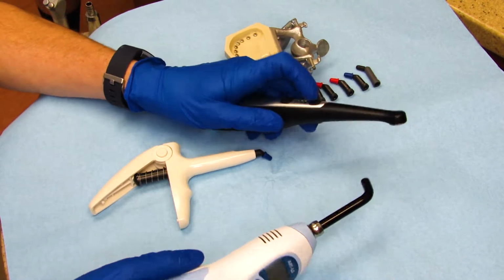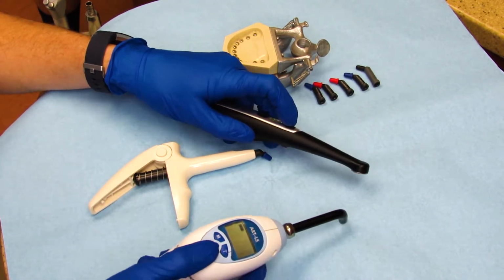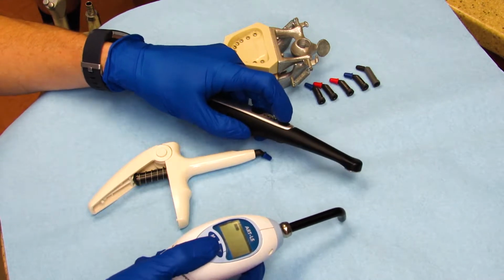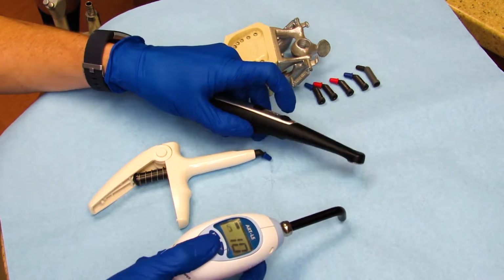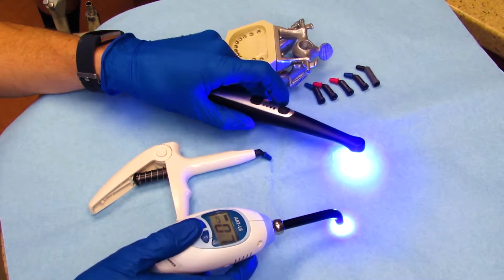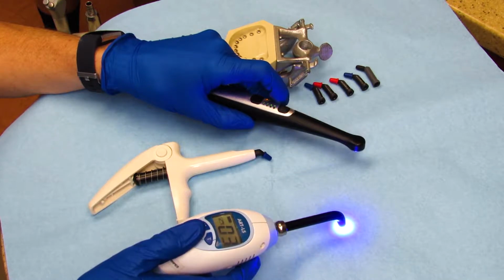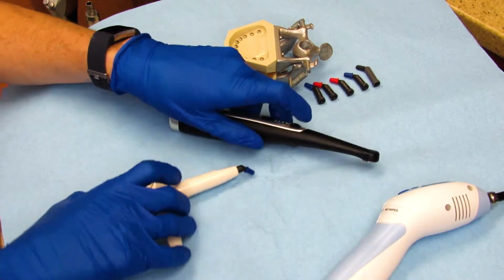This is another version. It's an earlier model of a different brand, but I want to show you the difference between the two. Here we go. Watch how much less power comes out of this lower curing light and how much longer it takes. Another about 10 seconds. So, what are these used for?